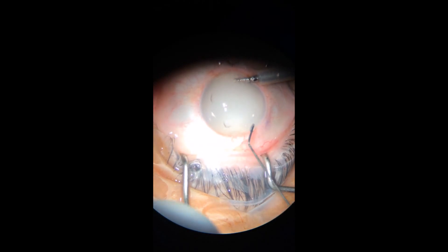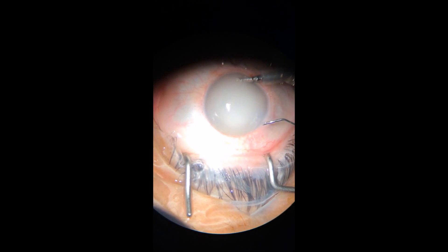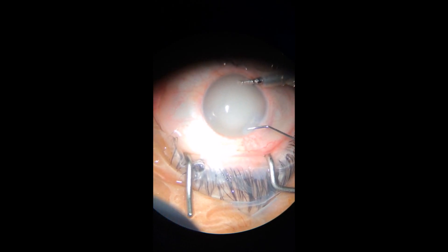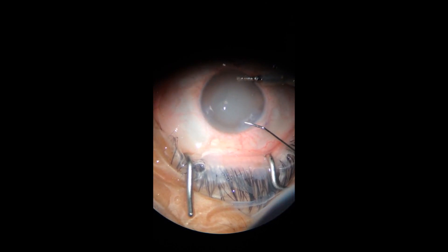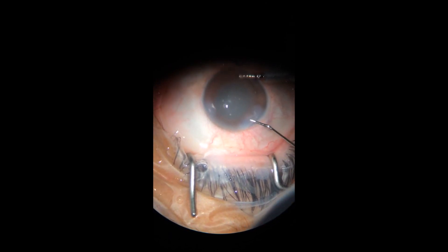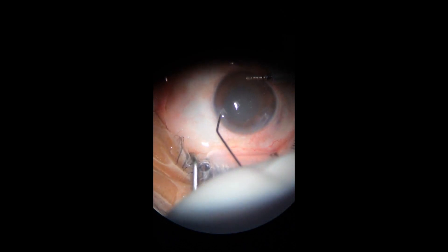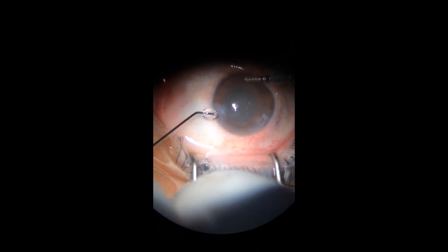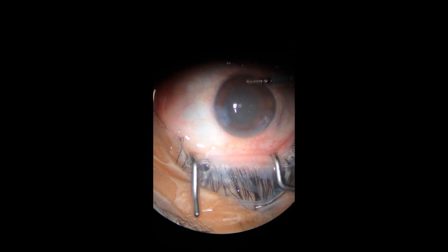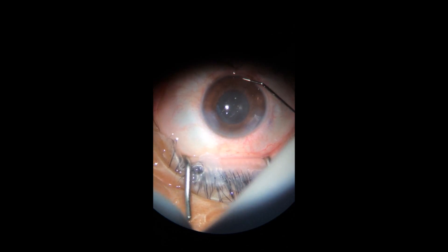I usually do at the end of surgery some triamcinolone to take care of the inflammation that you can sometimes get from phaco, and by the time the surgery is done all that triamcinolone is washed out. For patients who may have a rise in IOP, I give them some medication to lower it for one day. Thank you, I hope you enjoyed this video.